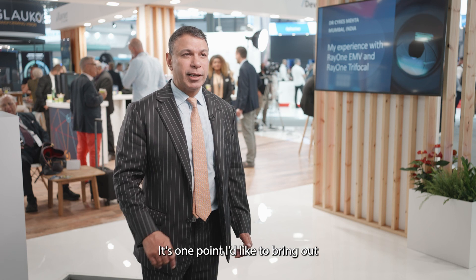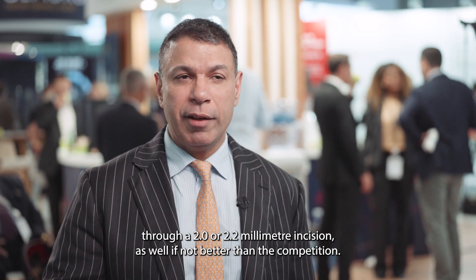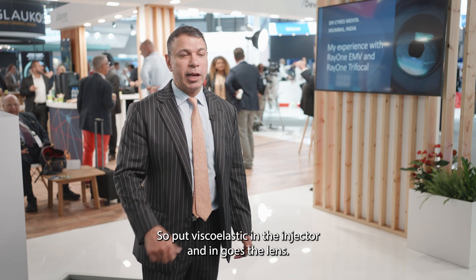The Rayner injection system is fantastic — it gets into the eye through a 2 or 2.2-millimeter incision as well as, if not better than, the competition. That's very important because I inject my lenses without viscoelastic in the eye: put viscoelastic in the injector and in goes the lens. It has to fit right in the tunnel.